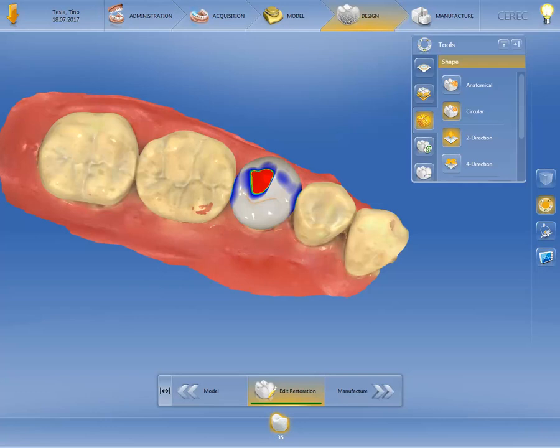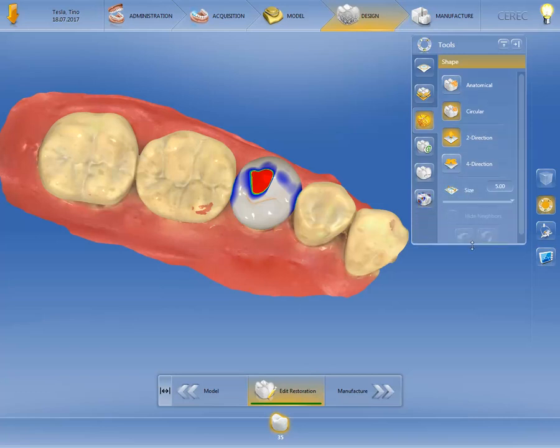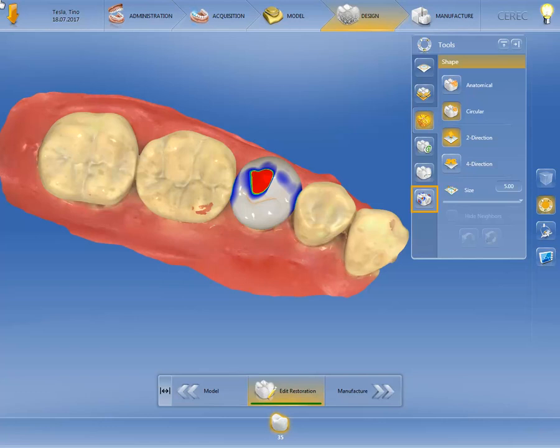The revision resulted in occlusal penetration of more than 100 micrometers. You can use the tool Adjust Contacts to quickly and efficiently adjust the mesial, distal, and/or occlusal contact surface according to previously defined restoration parameters.